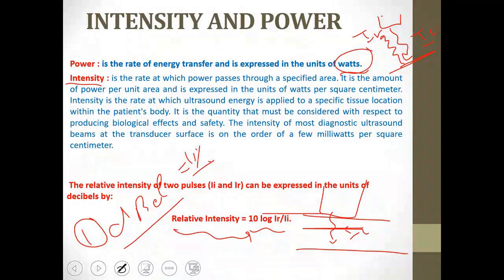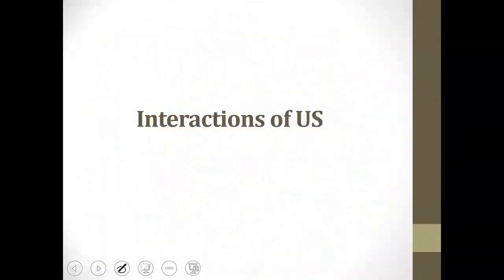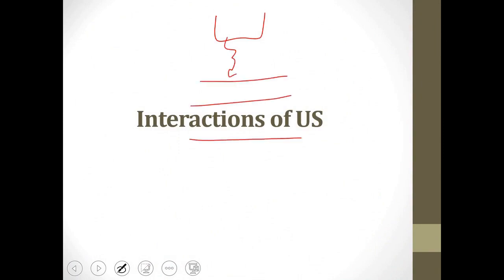You get a completely homogeneous image. Now, here is the example. Let's assume the transmitted signal is 100. All that is reflected here, let's say it's 20. So how much did it pass, doctor? 80, right? It was 100 and it passed 80. Okay, so this 20 came from this distance.